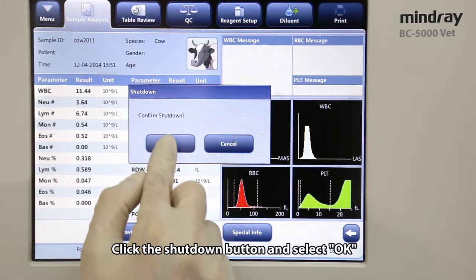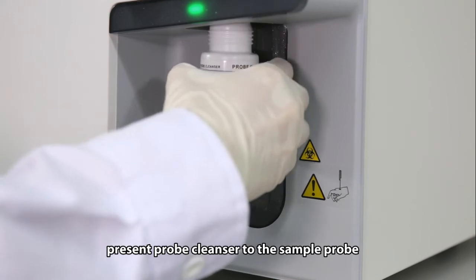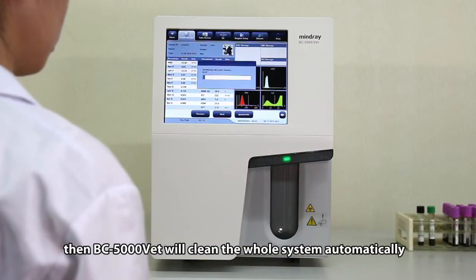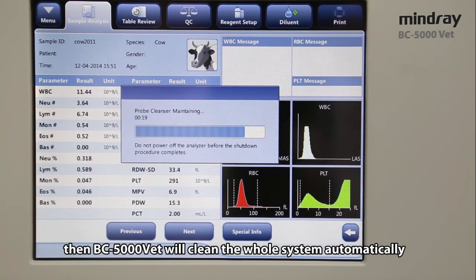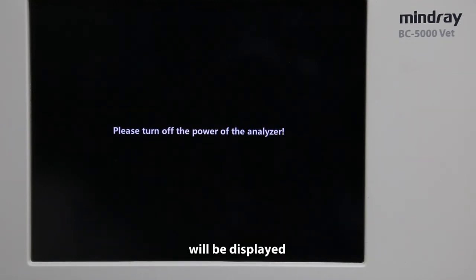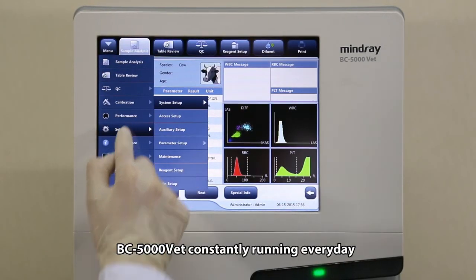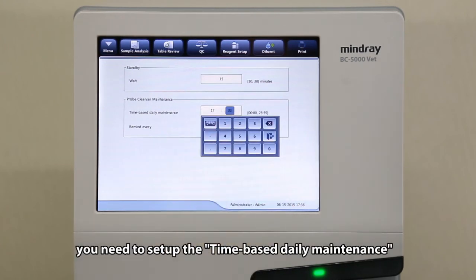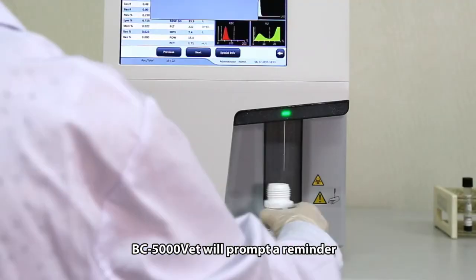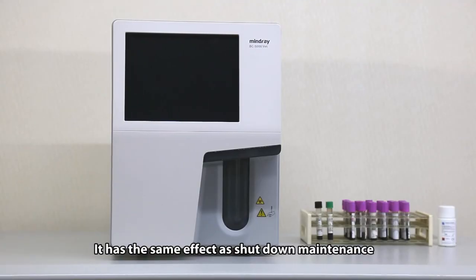Click the Shutdown button and select OK. When the dialog box for prompting probe cleanser maintenance is displayed, present probe cleanser to the sample probe, then press the aspirate key. The probe will aspirate the probe cleanser, then BC 5000 VET will clean the whole system automatically. After shutdown finishes, the message 'Please turn off the power of the analyzer' will be displayed. Press the power switch on the back of the instrument to power off. If you would like to keep BC 5000 VET constantly running every day, you need to set up the time-based daily maintenance. BC 5000 VET will prompt a reminder for probe cleanser maintenance when needed, and it has the same effect as shutdown maintenance.